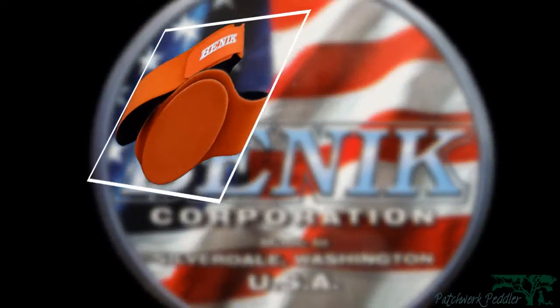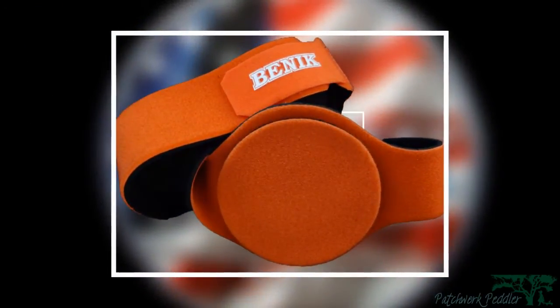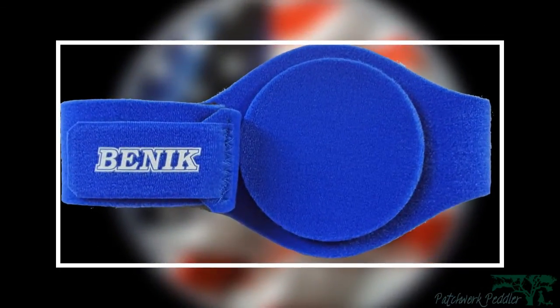Thank you for choosing Patchwork Peddler. In this video, we are going to be highlighting the features, benefits, and accessories of the Benik Feeding Tube Belt.